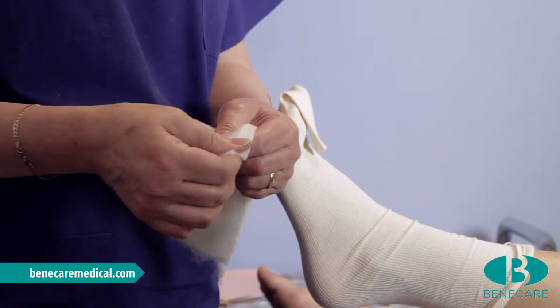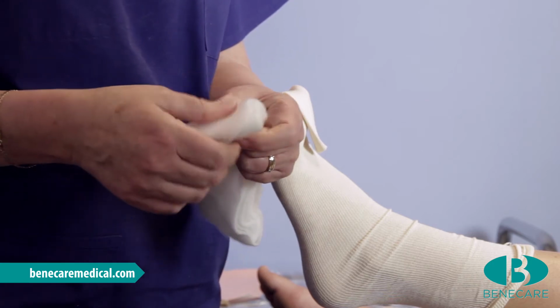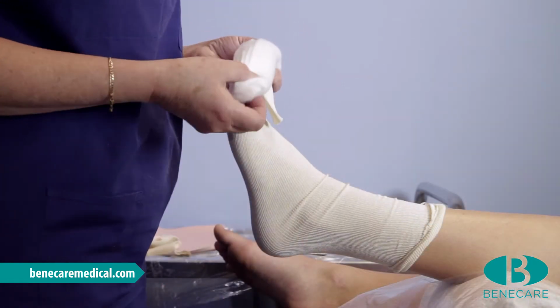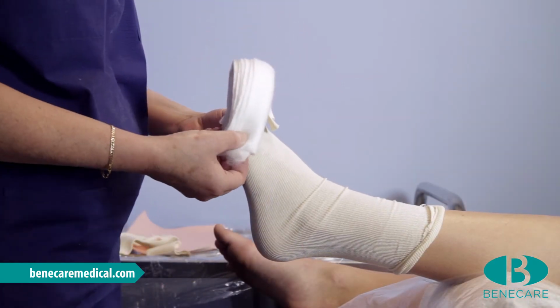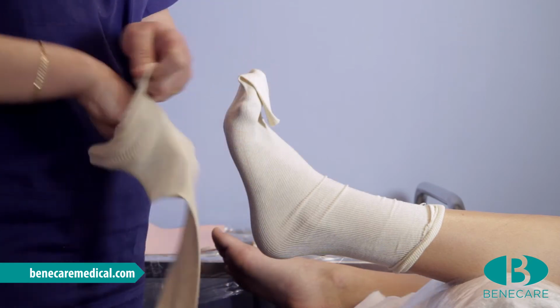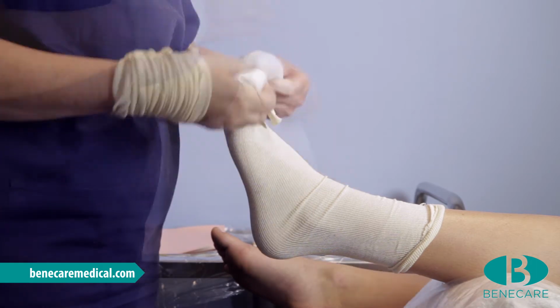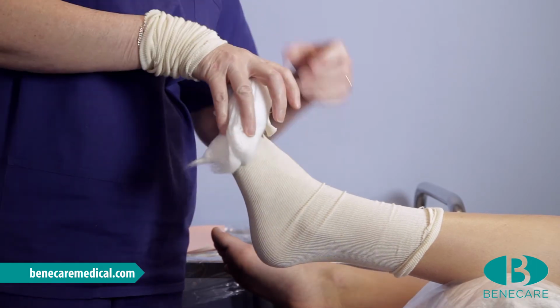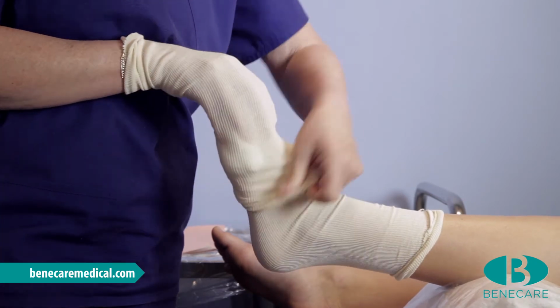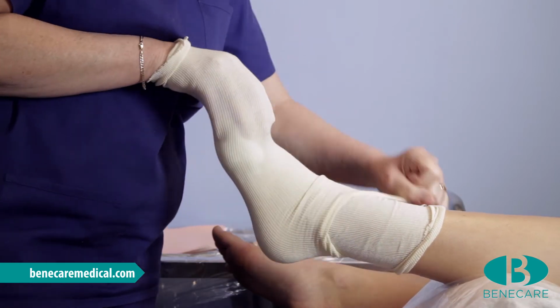Tease the slab at both ends to prevent any ridges developing in the cast. Fold the slab to make 12 layers and position the slab across the apex of the toes, from metatarsal head to metatarsal head. Put the second layer of stockinette on your hand to aid with the application. Slide the stockinette onto the foot whilst holding the padding in place. Ensure the padding is positioned directly on the apex of the toes and not on the plantar aspect.